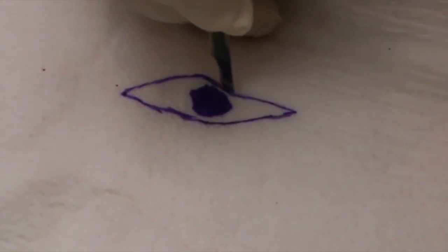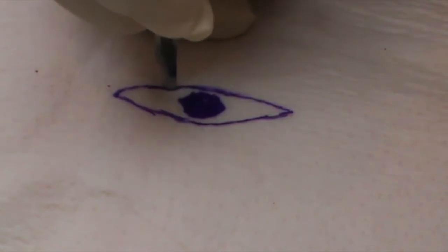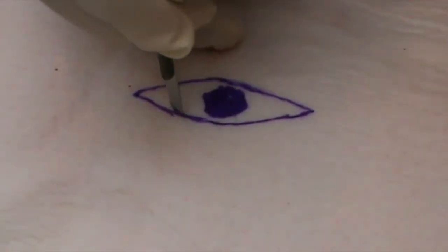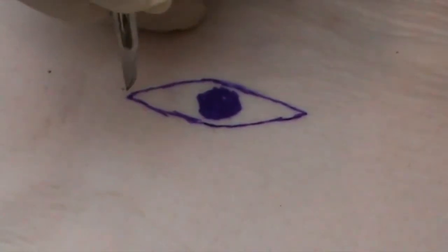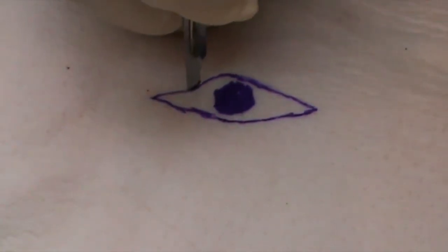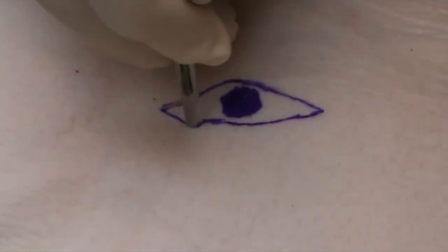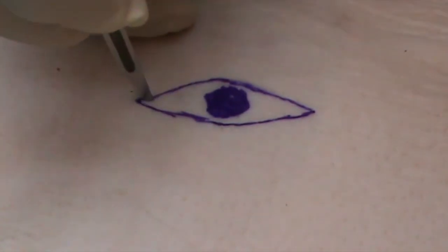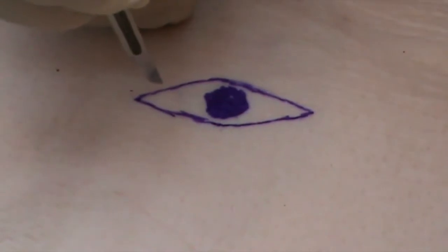There's always a temptation to cut on the inside, which will then reduce the margin to your lesion. So with both of these, we've cut so far. Then we turn the scalpel round and come back in the opposite direction to join up with our incision line. The reason we do this is to try and avoid the temptation to cut over — that so-called fishtail.